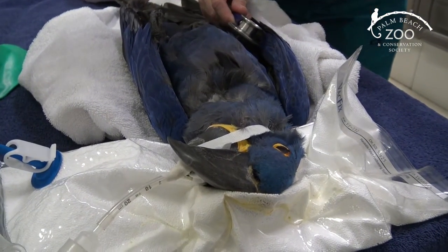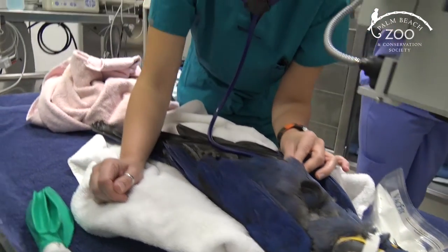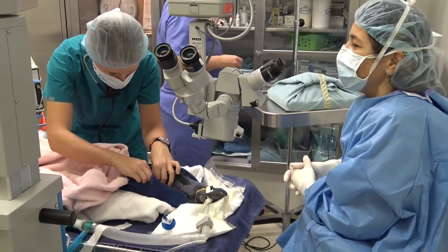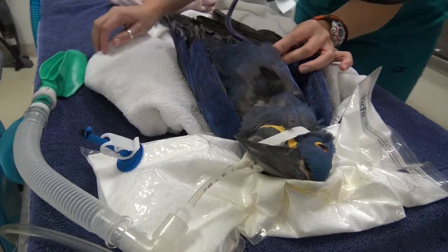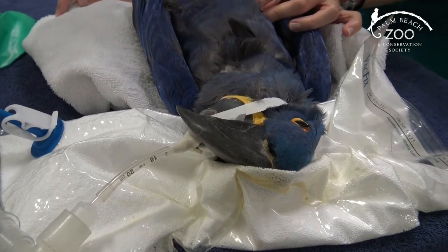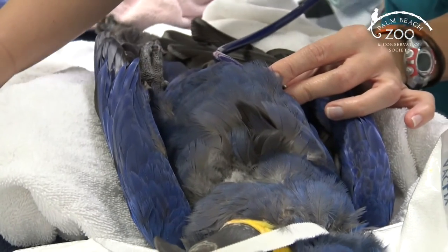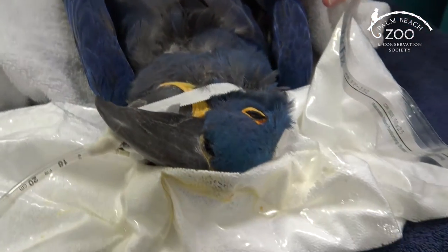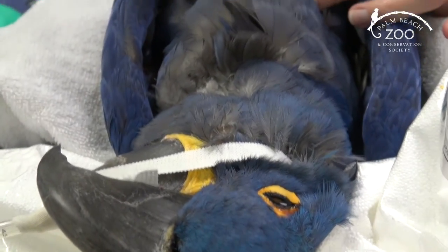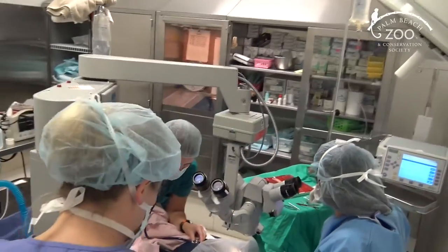The entire surgery, Paris was monitored by veterinary technologist Erin McNally. We continuously monitored his heart rate with a stethoscope, his pulses, and his oxygen and carbon dioxide flow — typical in any anesthesia. We actually breathed for him to maintain a constant level of anesthesia, because during eye surgery it is incredibly critical that nothing flinches — not even any muscles in the eye — given how delicate the work is.